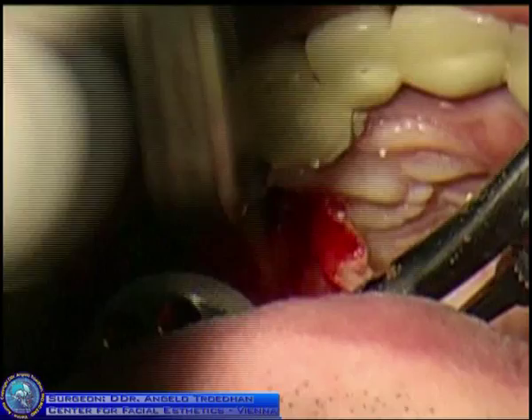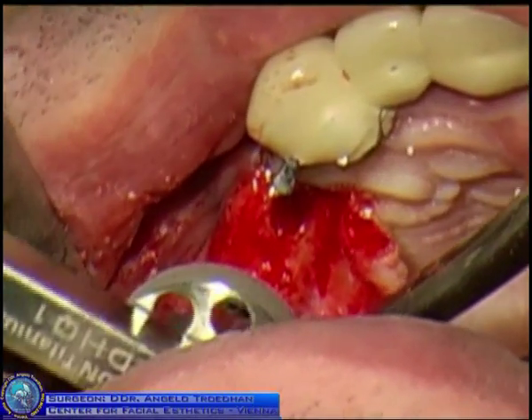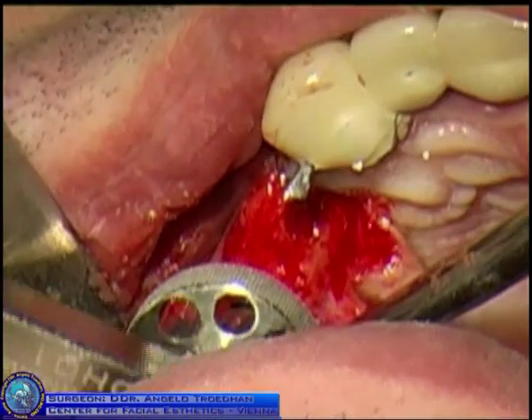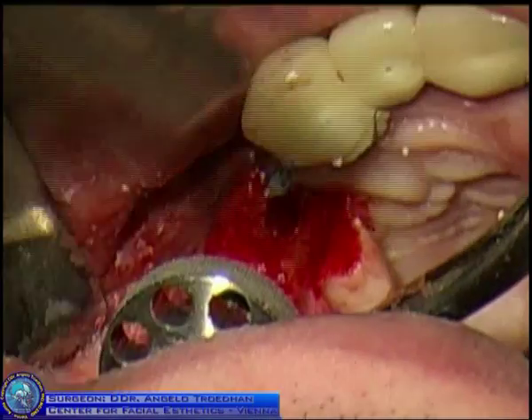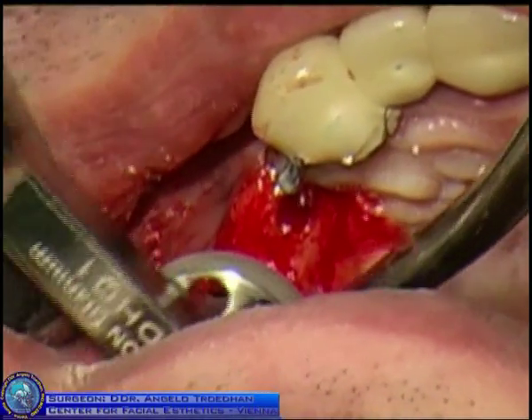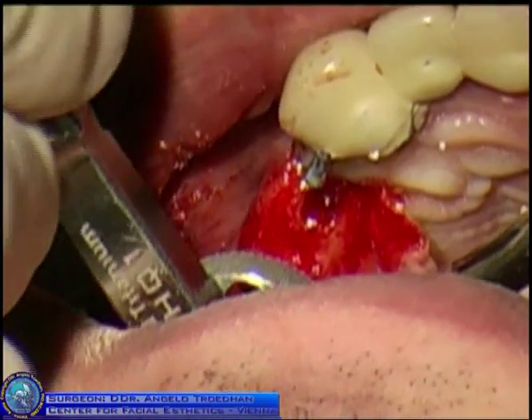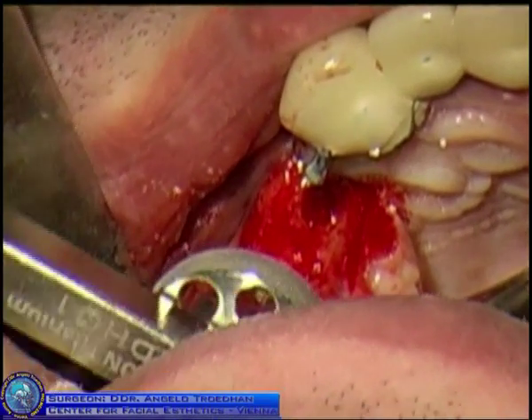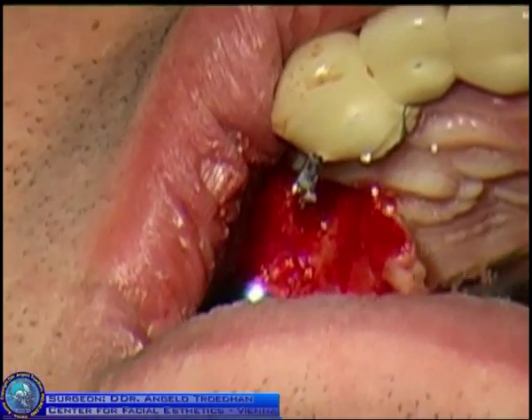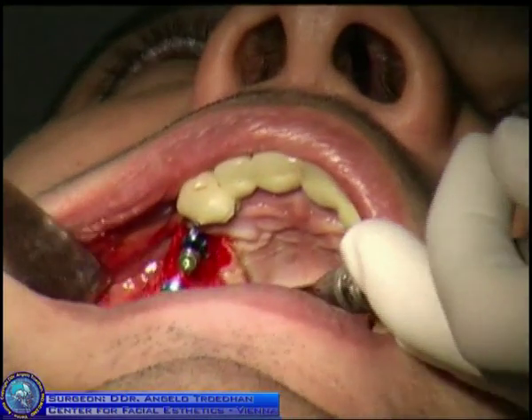Which is exclusively meant to carry prosthesis. That means after surgery there is a little metal pole showing out of the gingiva. And inside the removable prosthesis, a matrix is polymerized, giving hold to a partial or full total prosthesis. The rest is usual business.